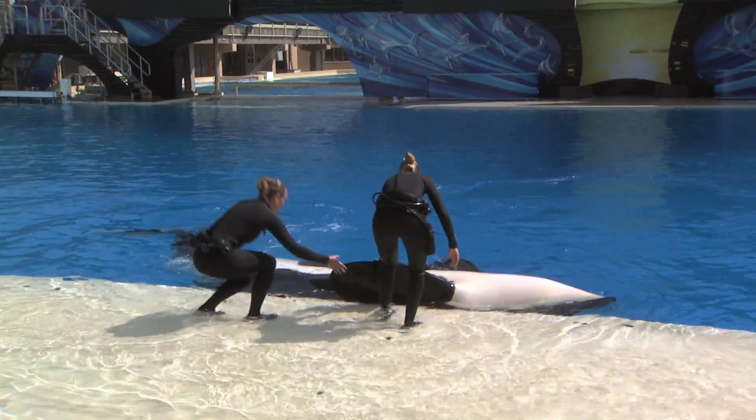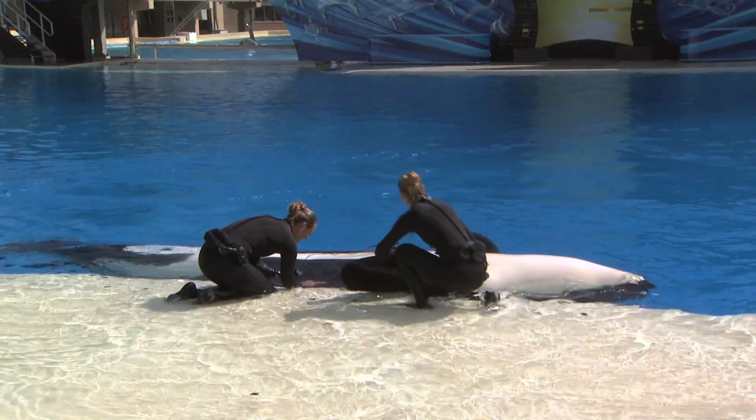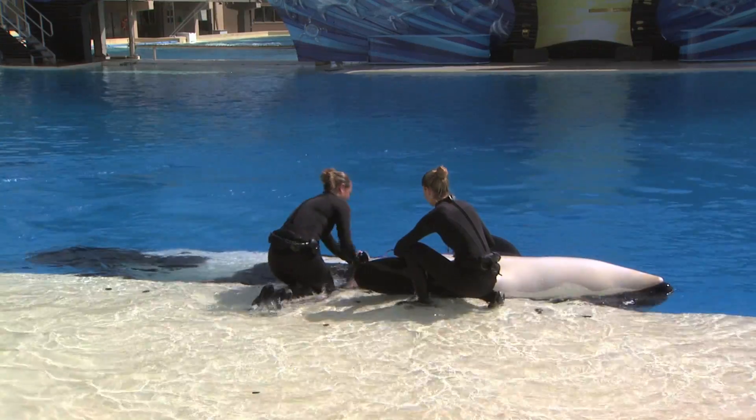We chose Corky as the animal. She's very comfortable with most husbandry behaviors and enjoys partaking in her own health care. So we slowly started to desensitize her and condition her to the suction cups — first touching with our hands, then slowly touching with the suction cups, eventually getting to where we could place them on her and then extending that period of time.